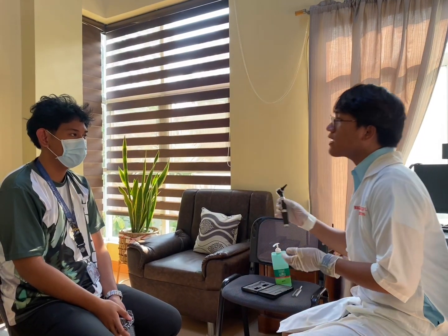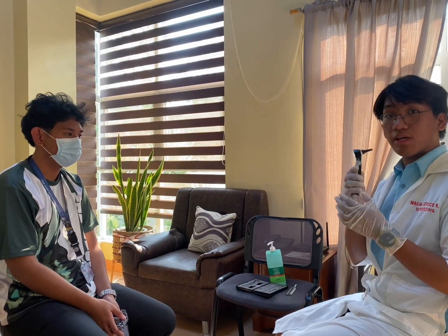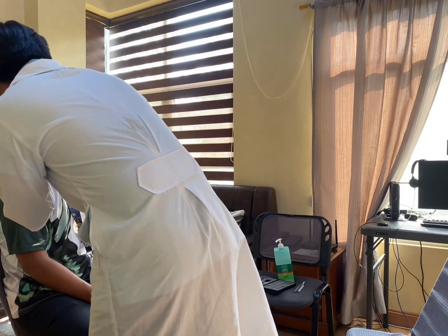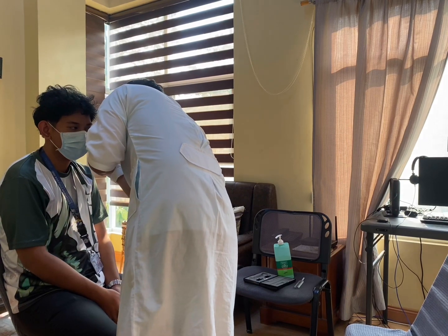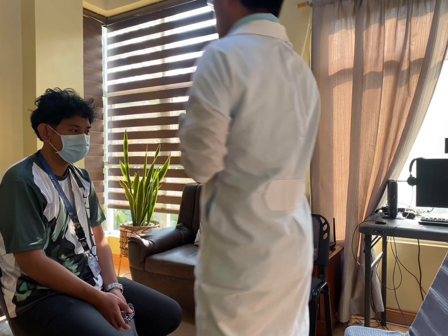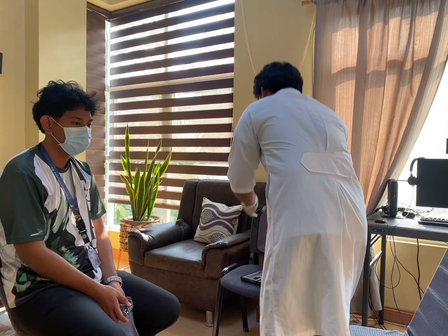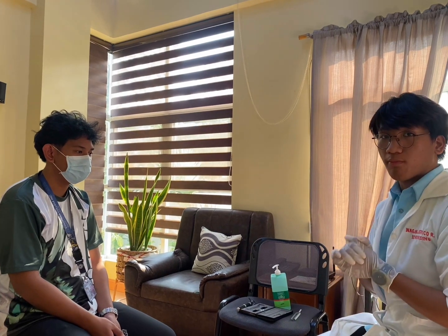Next, I'll be inspecting your tympanic membrane for its color and gloss using my otoscope. Okay, as I observe, I don't see any signs of abnormalities such as inflammation or infection. Next, I'll be doing the gross hearing acuity test for a normal voice tone.